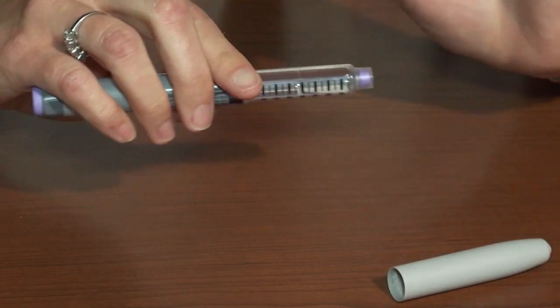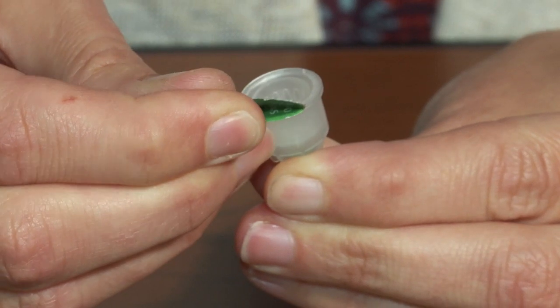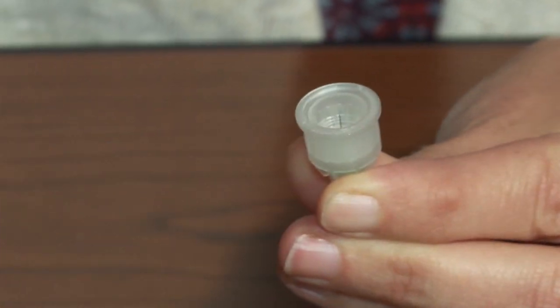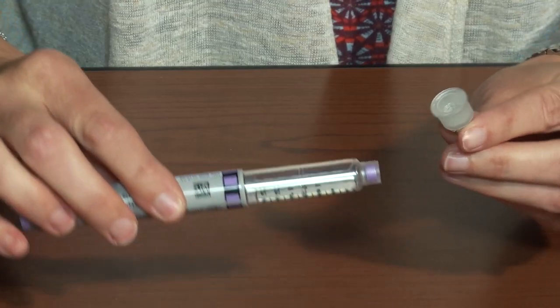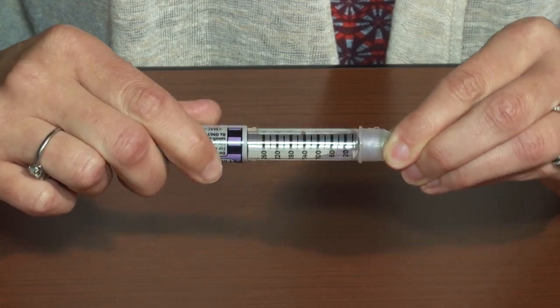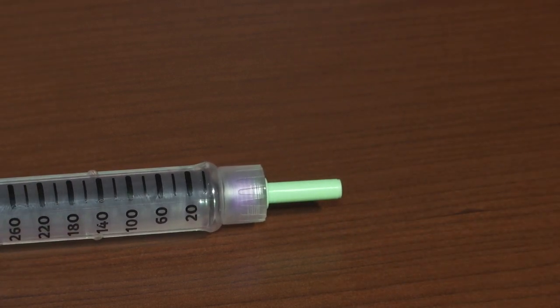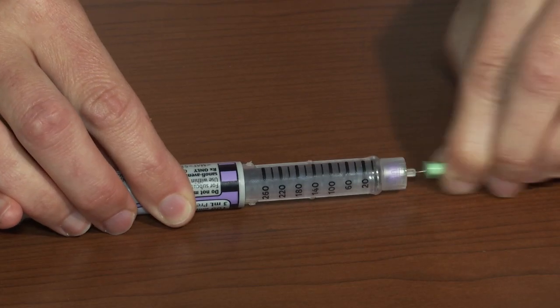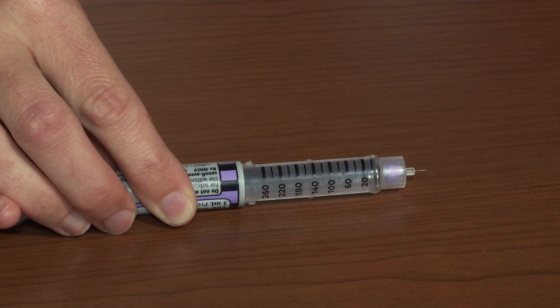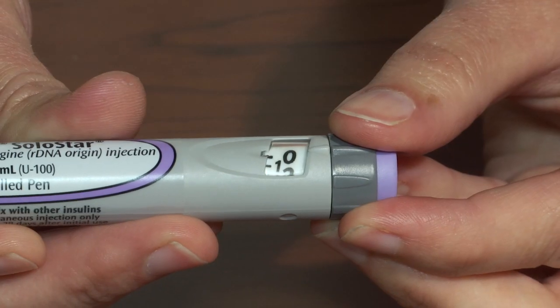Select a new pen needle each time and remove the protective paper covering. Screw the pen needle onto the insulin pen. Pull to remove the clear plastic cap and set it aside. Now remove the colored plastic needle guard from the needle and discard.